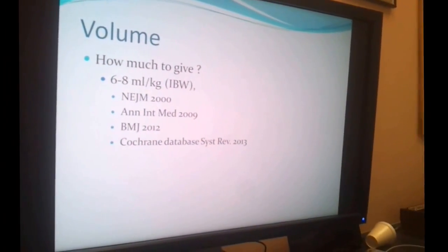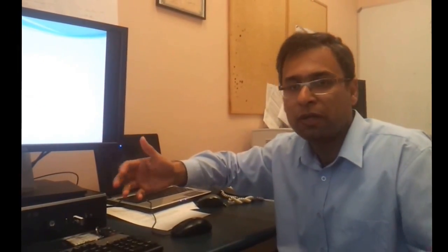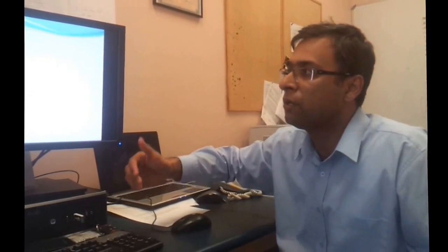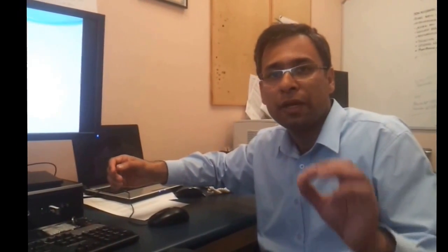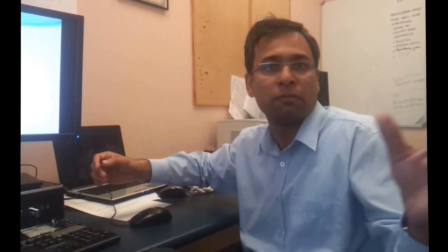If you're giving a standard person who is like a 21-year-old, comes in with an overdose of a drug, no known lung problems, decreased GCS, you give him a general intermittent positive pressure ventilation strategy, which will be 8 mils per kilo. If someone is again 21, has got a viral pneumonia with bilateral shadowing, diagnosis possible ARDS, you give them lung protective strategy, which will be 6 mils per kilo.